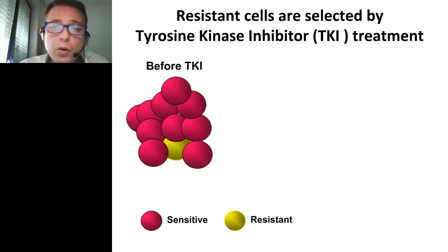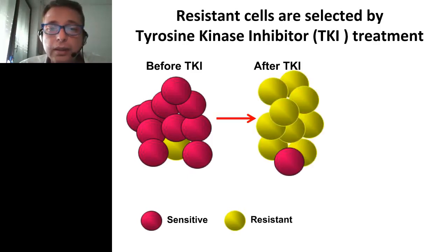And of course, we can try to identify the different molecular alterations that are present in colon, lung, or other tumor types by using the methods that we usually run in our labs that are also used for clinical diagnostics, such as sequencing, real-time PCR, FISH, or immunohistochemistry. However, the time, the cost, and the amount of tissue that are required for this approach are not compatible with clinical research, in particular in some settings.